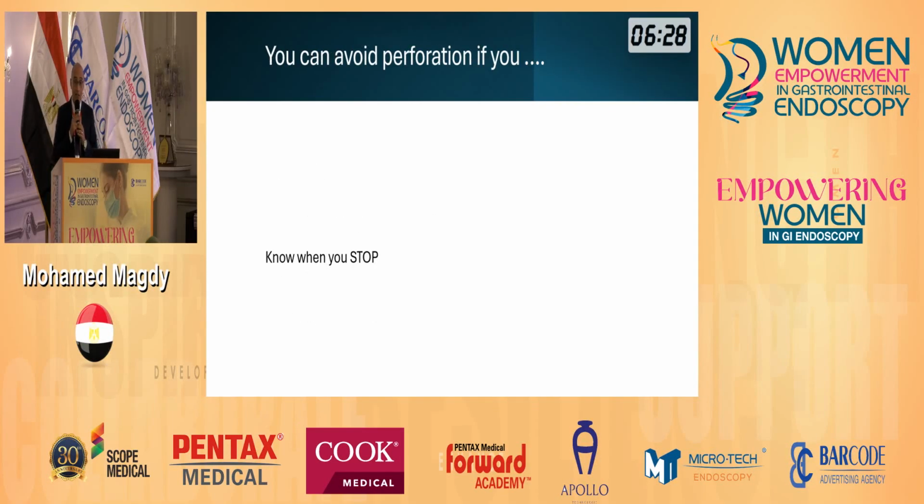And the second thing I had learned from Dr. Khalid: you should know when to stop. To stop, to not continue the procedure, is better than to have a catastrophe.